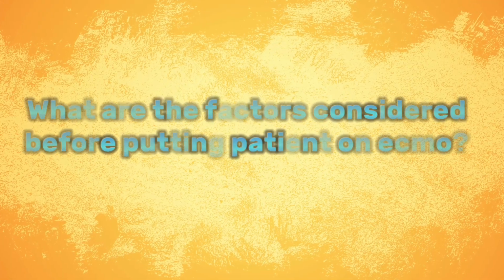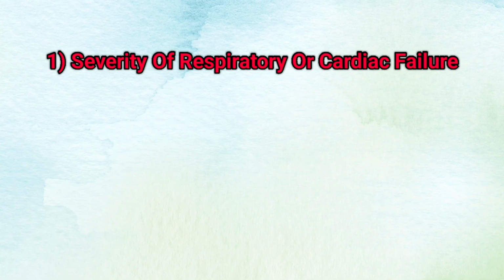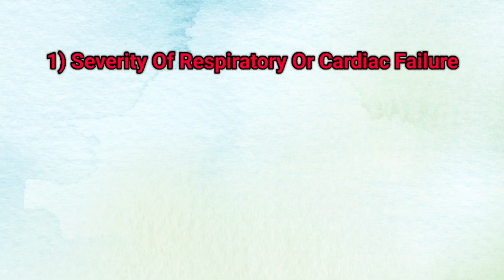Okay, now what factors are considered before putting a patient on ECMO? First is severity of respiratory or cardiac failure. If the patient is not responding to maximal medical therapy, including mechanical ventilation, inotropic medications and vasopressors, then the patient can be put on ECMO.